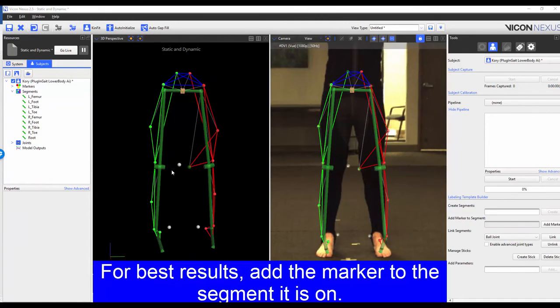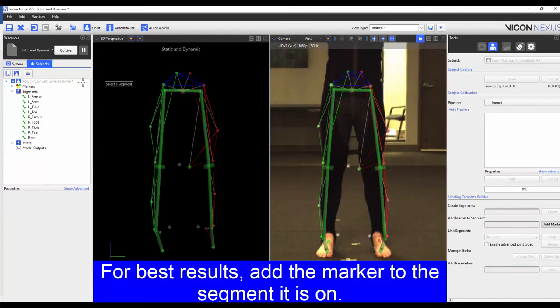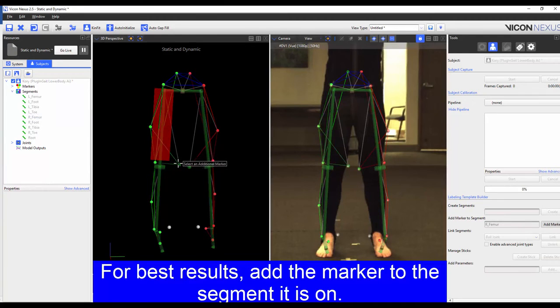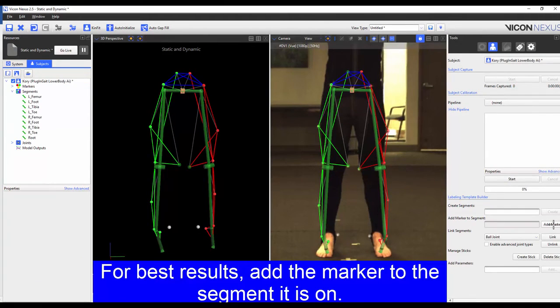I'm going to be repeating the process for the right medial knee marker. However in this example I'm going to choose the right femur segment from the segment list. I'm going to repeat the process for the remaining markers.